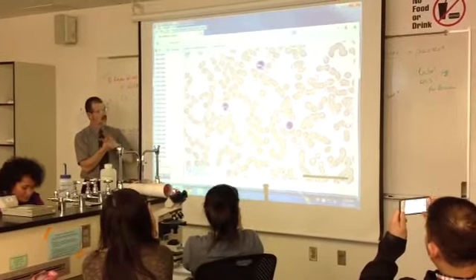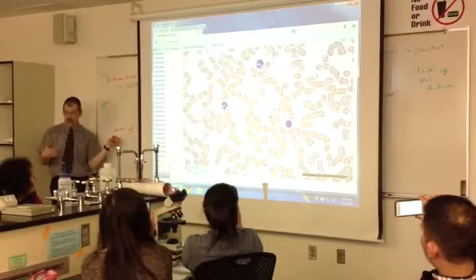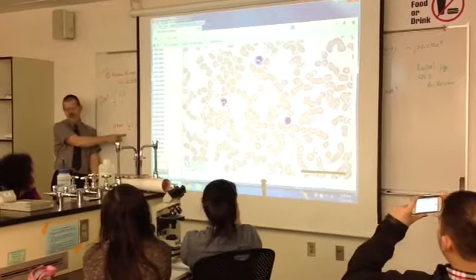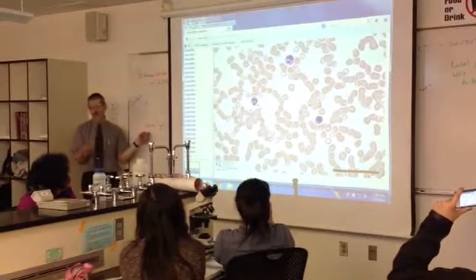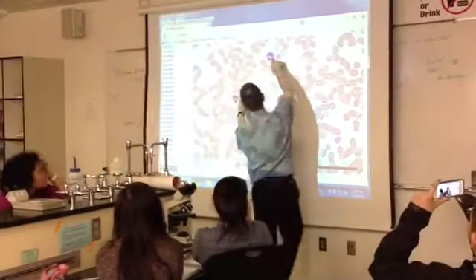So white blood cells, you want to remember, never let monkeys eat bananas. That's the order. So neutrophils most common, lymphocyte, monocyte, eosinophil, basophil. So if in doubt, it's going to be a never or let. Those are over half of the cells. So if you just remember the order, statistics say it should be a neutrophil in there somewhere. So neutrophils look like this.